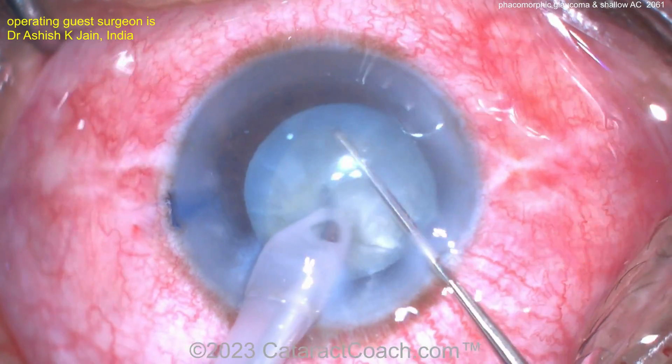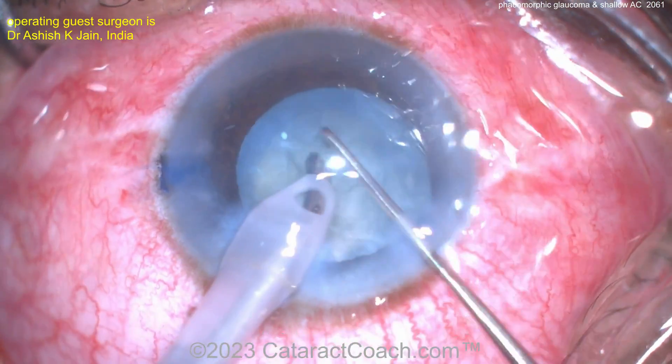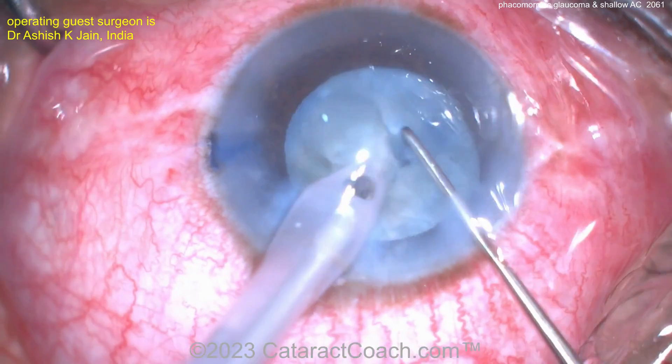Beautiful. Good rotation. Faco probe going in to hold it. Chopper working beautifully — a little vertical chop action here. Very nice. And now you can start removing these pieces.